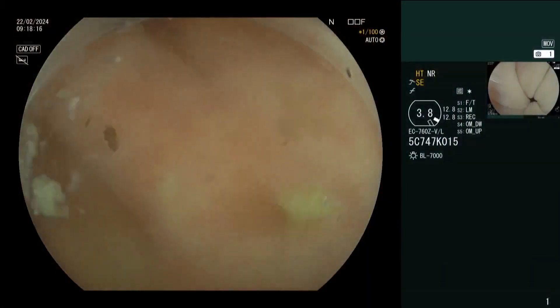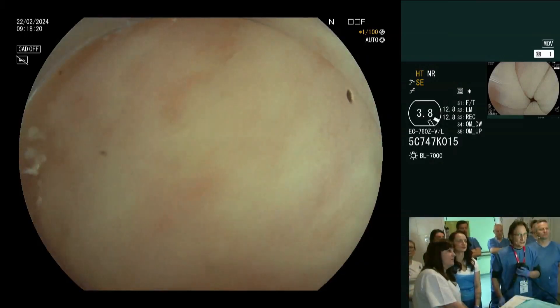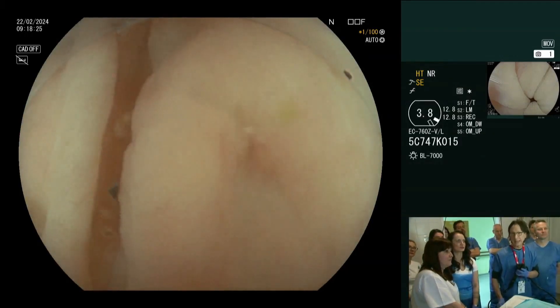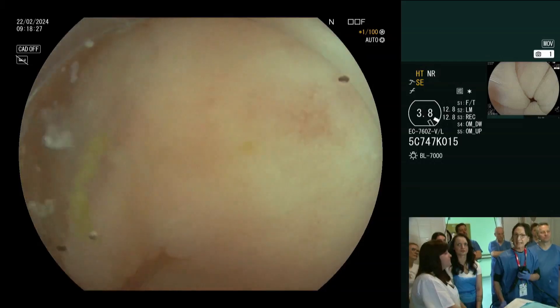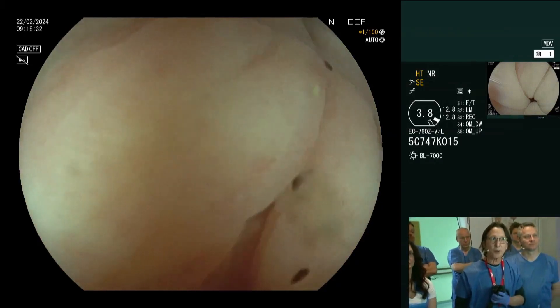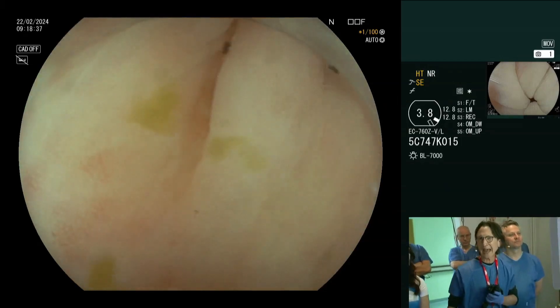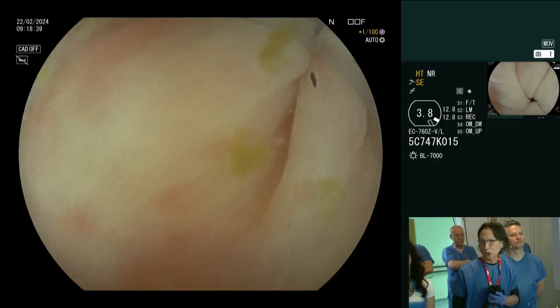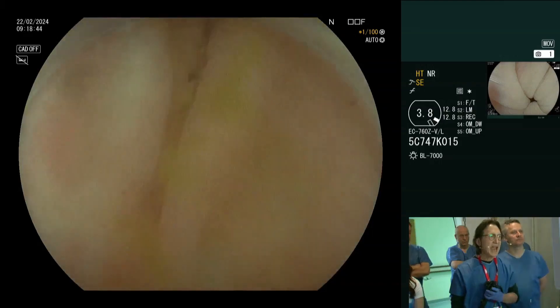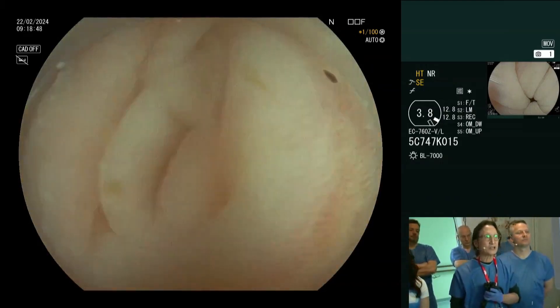When you're underwater, you can see the view here. I'm using a Fuji scope — it's not a scope I use in my unit; I use the Olympus 190Q — but this Fuji scope is an adult colonoscope with a 3.8 millimeter working channel, and it has near focus, or optical zoom — not electronic zoom, it's optical zoom. I've turned the gas off and intubated to the cecum.